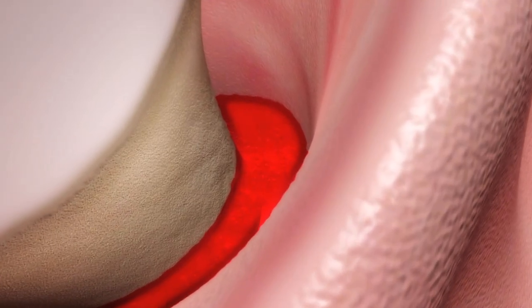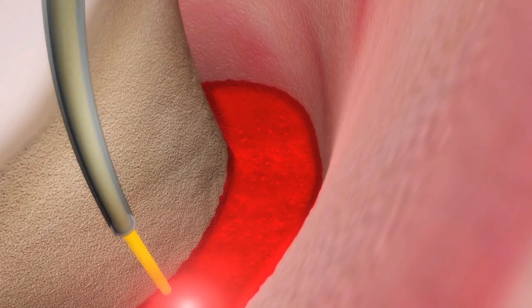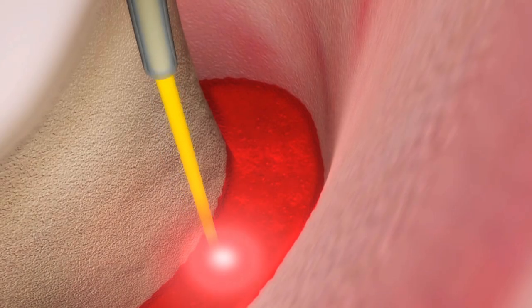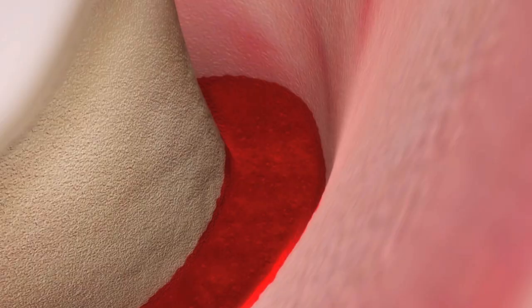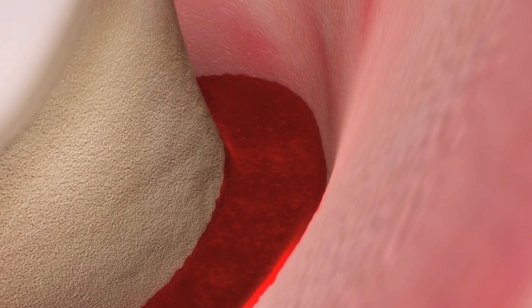Then, we again introduce ND YAG laser energy in the pocket to start development of the clot. We insert the tip all the way to the bottom of the pocket, then we fire the laser and draw out the tip until we see the blood start to get slightly darker. At this point, we stop lazing and start placing the collagen plug.